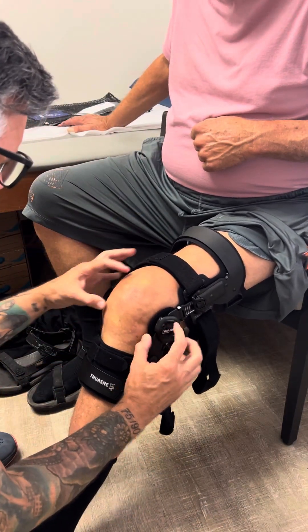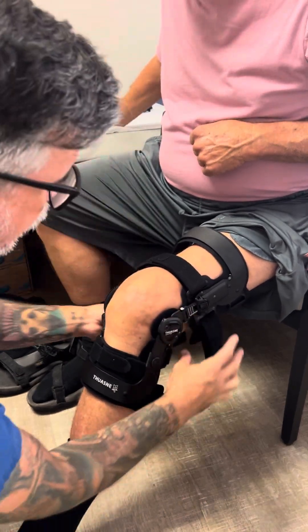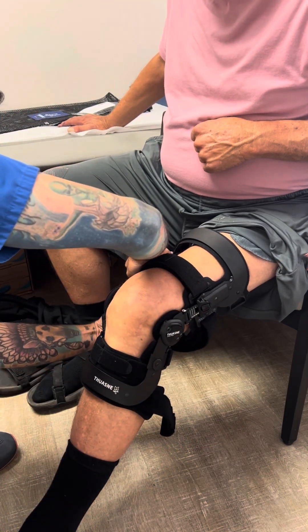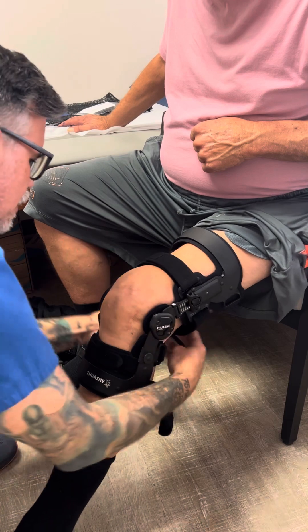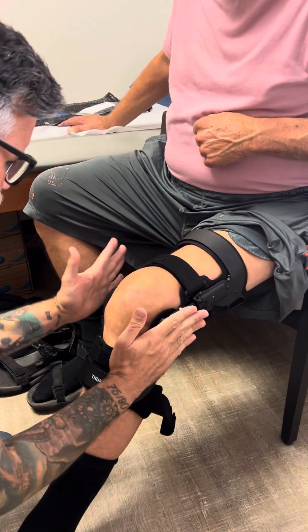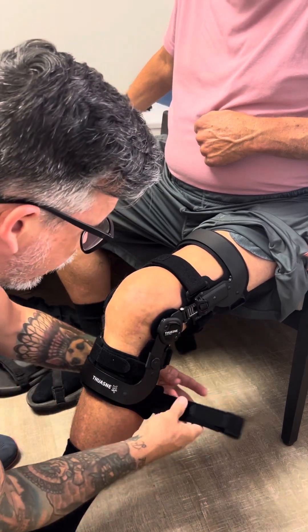Then make sure your alignment is still good — you can see the hinge of the knee is lined up with the hinge of the brace. Then do the strap right above the knee. The reason we like to do that is it gets the entire brace aligned with the knee joint perfectly. Pull it real tight, make sure everything is lined up and looking good, then you can do the thigh or the calf — it does not matter.